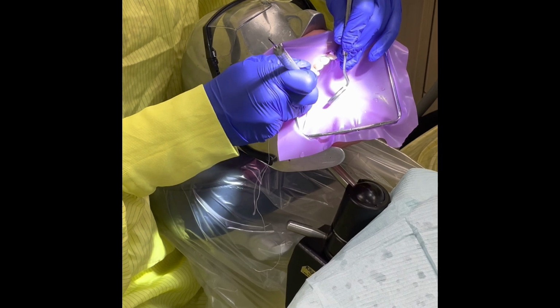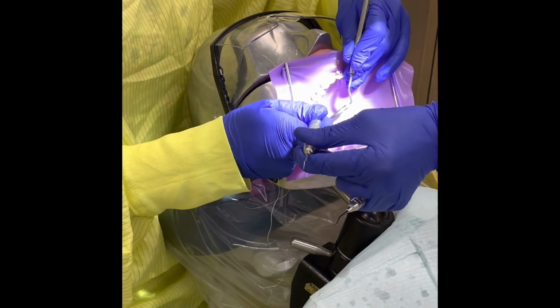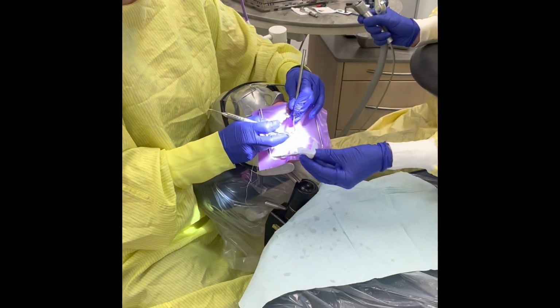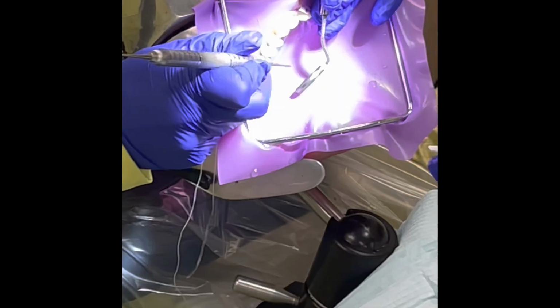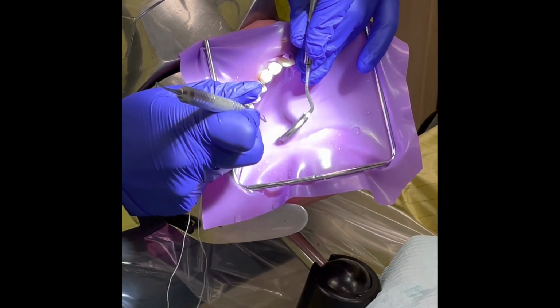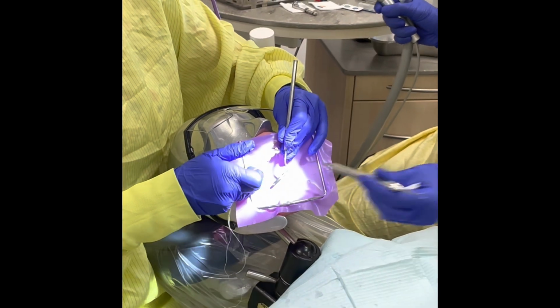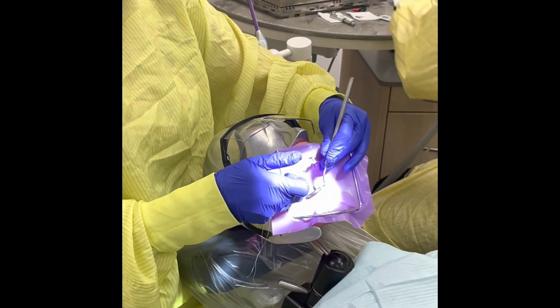Okay, so I would like my spoon excavator, please, Stacy. So we're going to do our transfer. As I'm using a cutting instrument, Stacy's going to have the gauze ready to wipe off for me. Okay, I'm complete with that. Everything looks good, so we are going to begin restoring with the anterior tooth, please, Stacy.